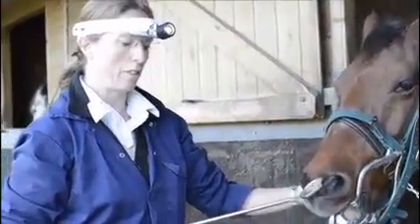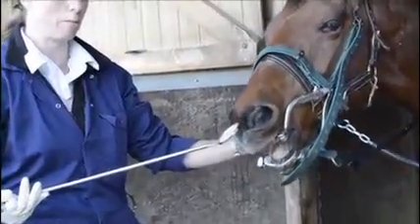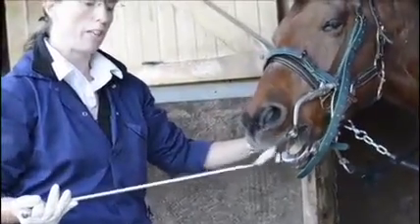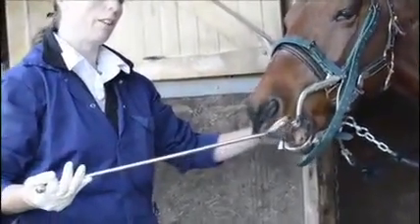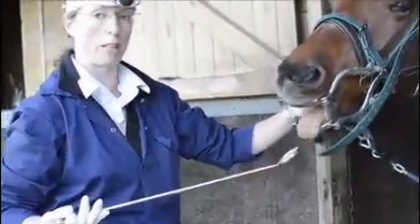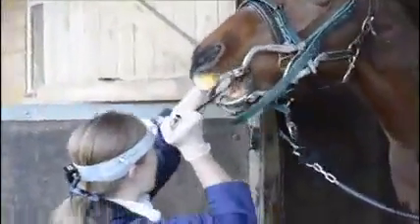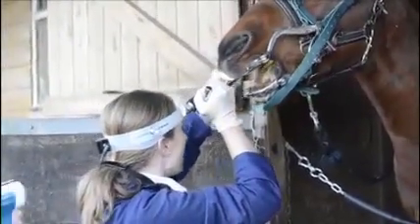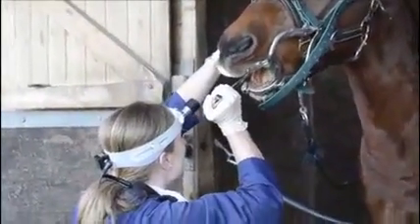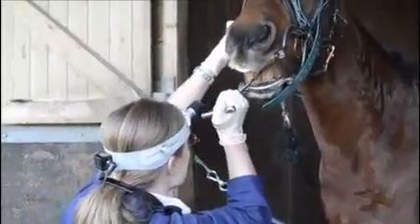And they're quite handy for us to have a look, because at the back of this horse's mouth we have a fracture on one side which is just chipped off some tooth a while ago. That's all fine, but we need to check that one, and we'll also check the tooth on the other side in the same position, because it's likely that this horse might have the same problem on the other side. So we'll see whether he'll let us have a little looky back here. And right to the back, and we can get a mirror image of that back tooth. And that looks good. And we'll compare it to this side.